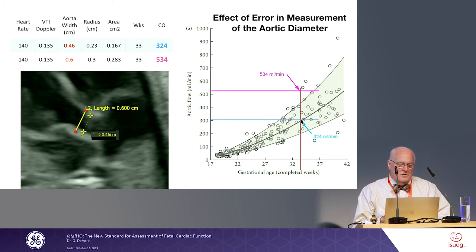However, if you have too much coffee and you just wiggle it, you go from 4.6 millimeters to 6 millimeters, just a little bit off like that. Look what it does to the flow. Now it's very abnormal.